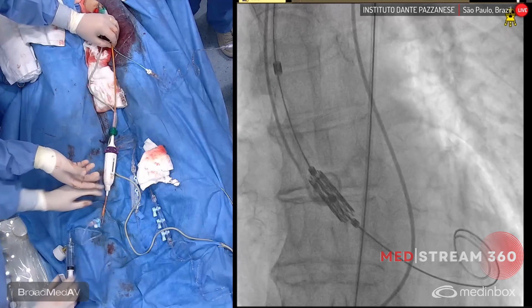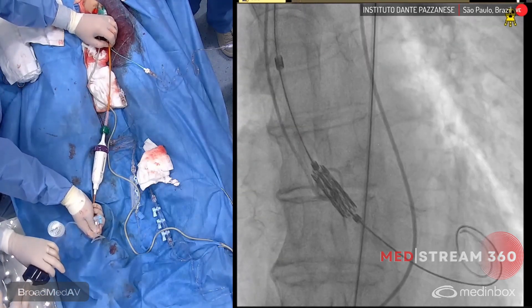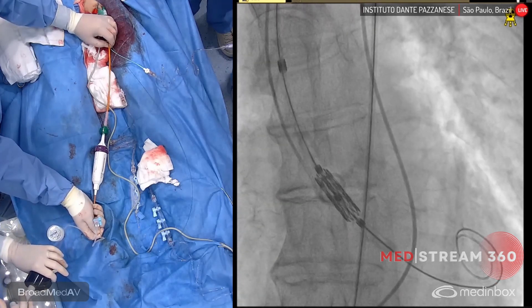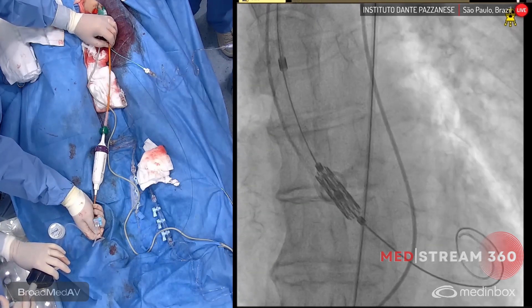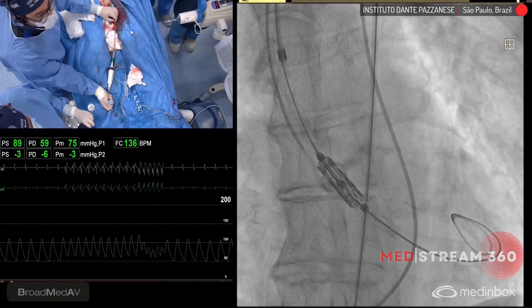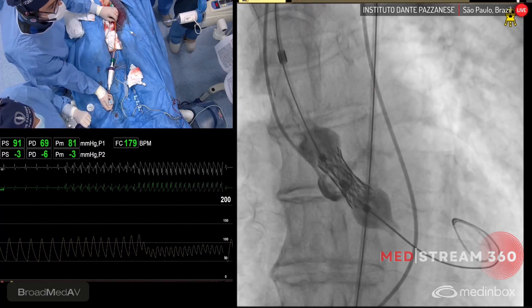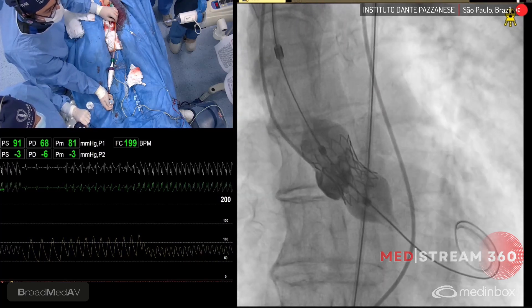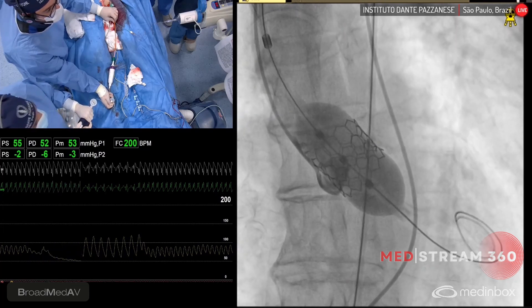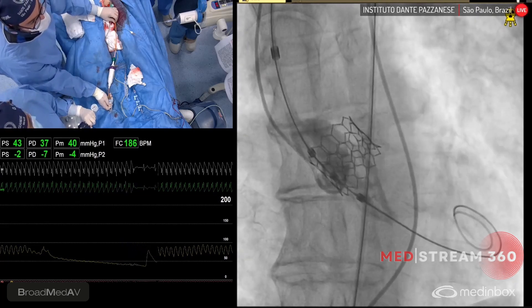Let's go. Pacemaker on, 120. Okay, 200. Inject. Yeah, that's a good position. One, two, three, four, five. And pacemaker off.